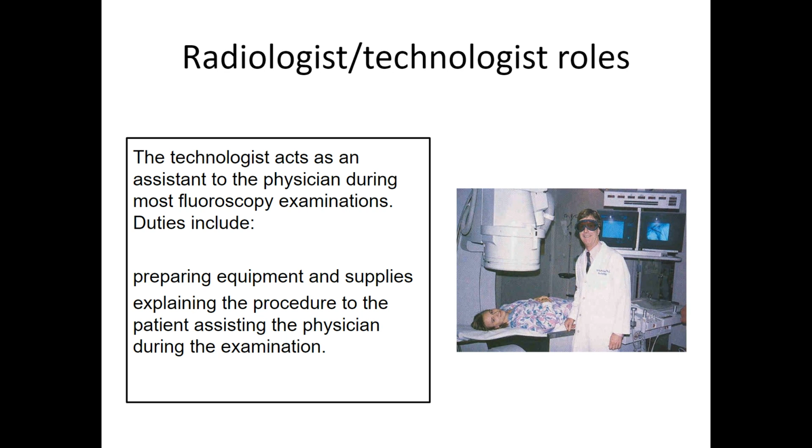The reason why it's called image intensification, or the II tube, is because typically all of these procedures were done in a really, really dark room because the image quality was not very bright. So to try to make things a little bit brighter, they would dim all the rooms. They'd use these like crazy glasses. And the idea now, besides being able to see these images in a dynamic kind of video way, is that we can save them digitally and they can be reviewed. You can see the video as it's happening in the room, but most times there's a monitor outside of the room as well, so you don't have to be in the room.